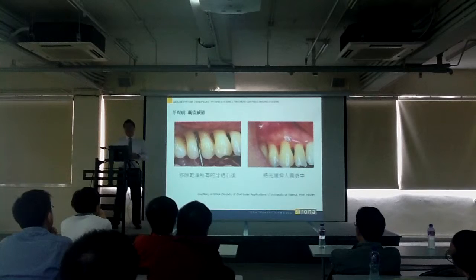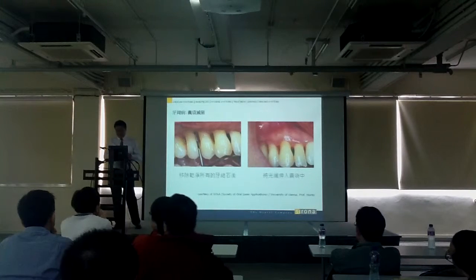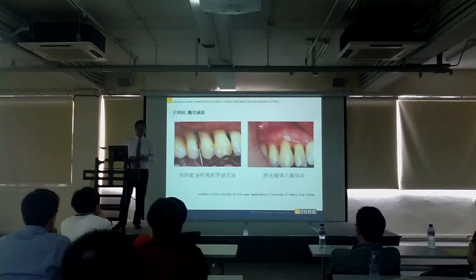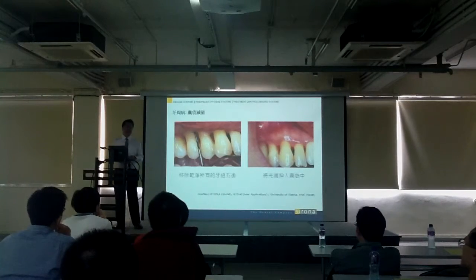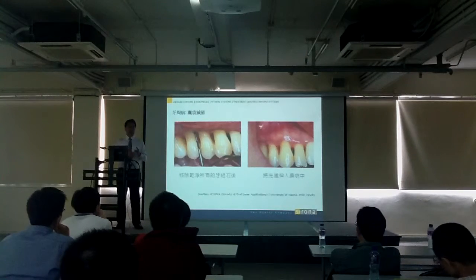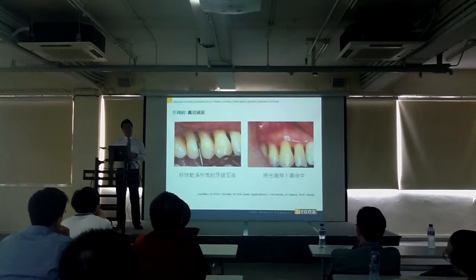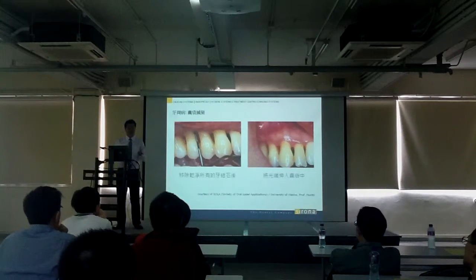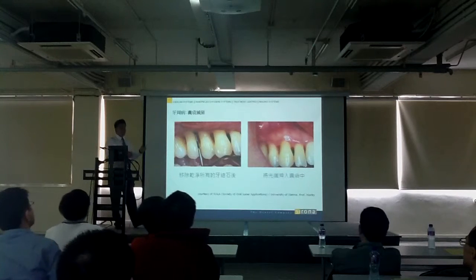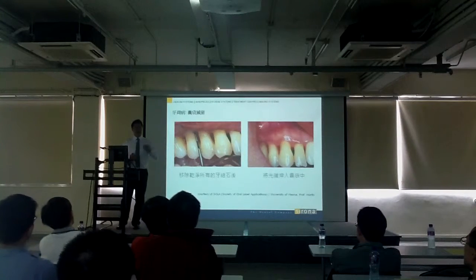Now, back to theory. Why can't we really have good control of periodontal disease? Mostly it's because we can't kill the bacteria very well. We can use local, some tablets that you put in. We can use systemic antibacterial, and then we can do irrigation, but you know the results. You know it's only effective probably 50%. That's it. So, with laser, you can really go in, localize, killing bacteria.